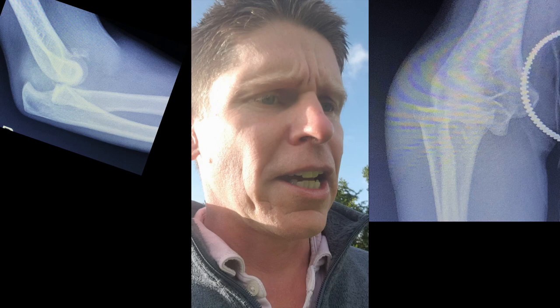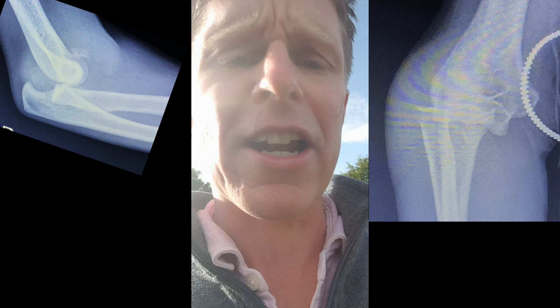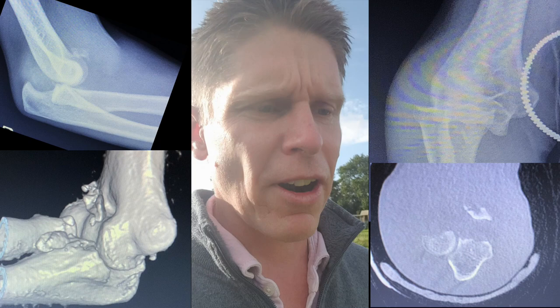It's a high-energy injury in a young individual, and you can see on the X-rays that there's a fracture of the radial head, which looks like a segmental partial articular fracture, and a fracture of the coronoid process. A lot of people's minds think of that as a terrible triad injury because you've got the association of a radial head fracture and a coronoid fracture.